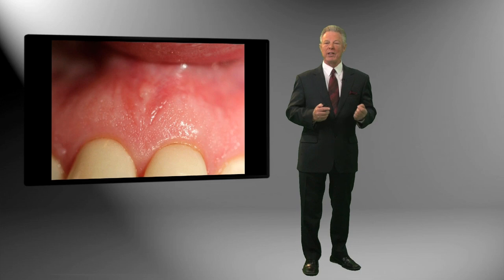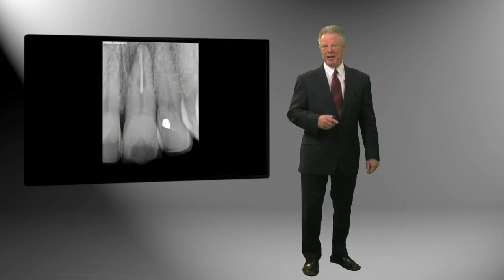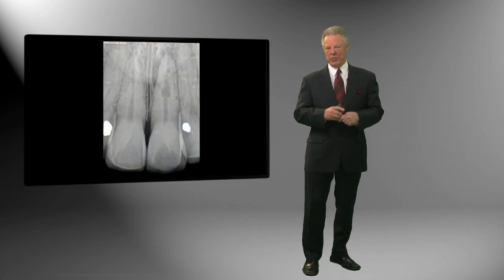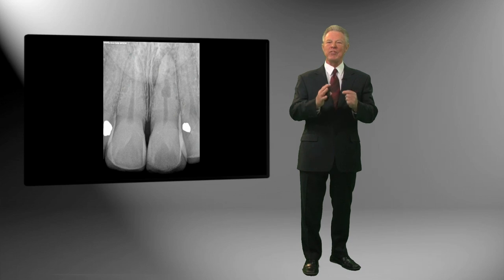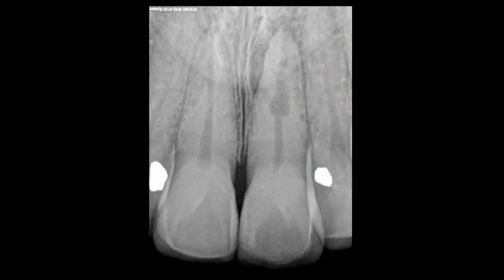There's a sinus tract that we trace that confirms, in fact, this is the culprit and the tooth that needs to be treated and can be treated. And so what I like to do is sit with my assistant, see the shape that's finished, hold that thought, feel it, and say to myself, you got it. And so let's do that. There's the patient's tooth. I want you now to imagine the right shape for this tooth, given that there's resorption, given there's a radiolucency. And so the shape that we imagine is this.